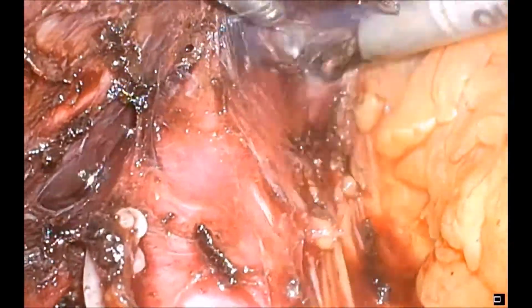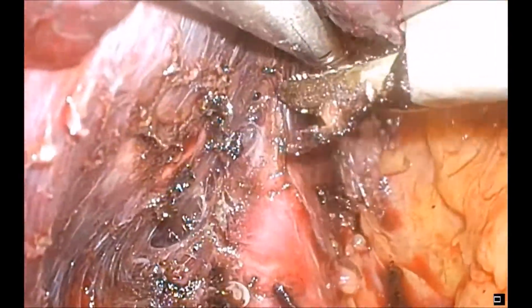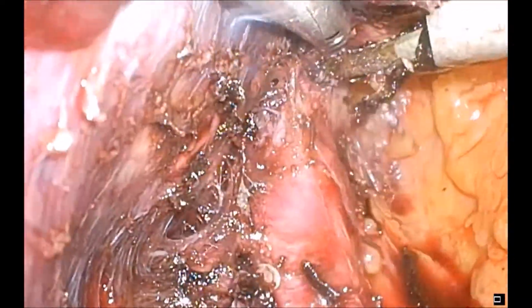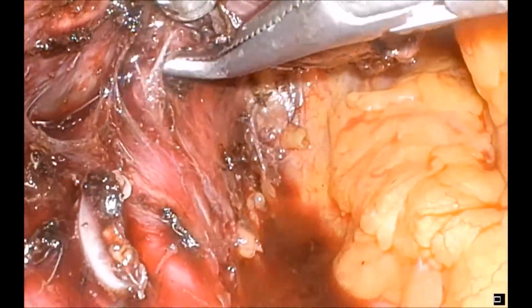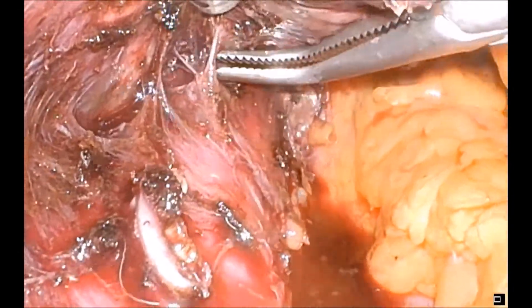The other advantage of the three-dimensional scope for this type of operation is that it does have a great deal of flexibility once it's inside the abdomen. It can turn around almost to 90 degrees, allowing the camera to be placed out of the way of the instruments and yet give a great view.